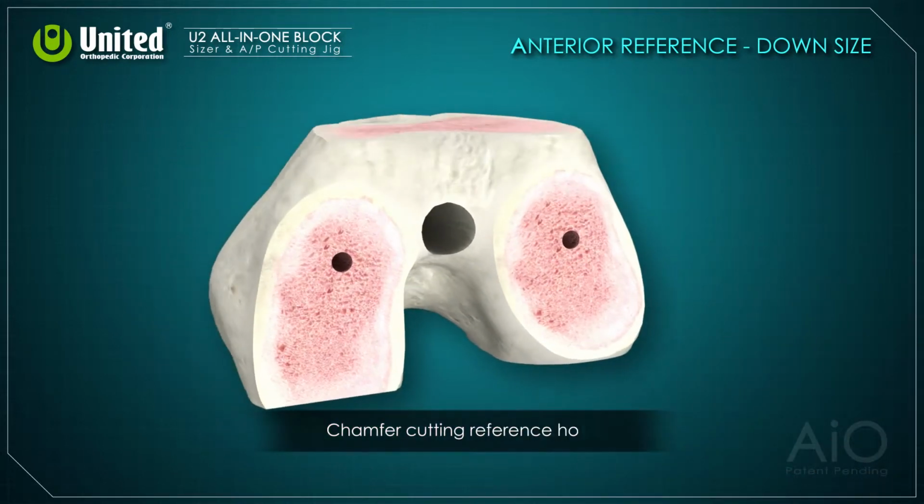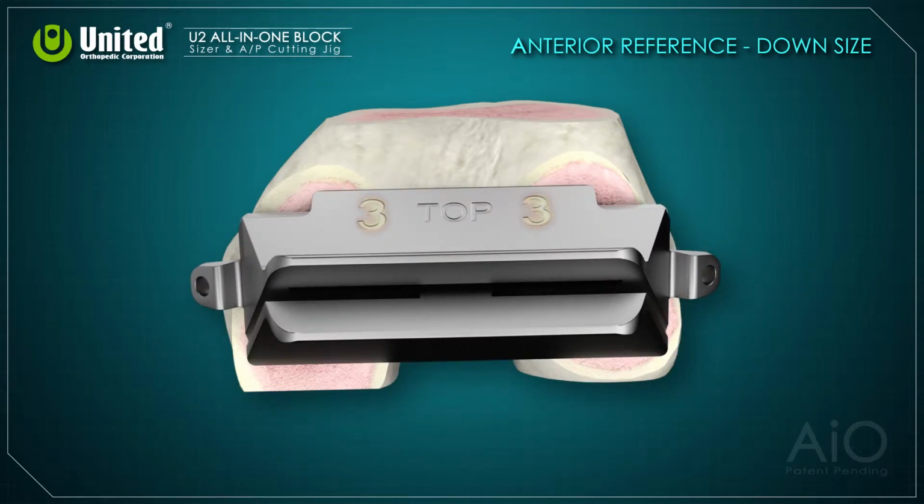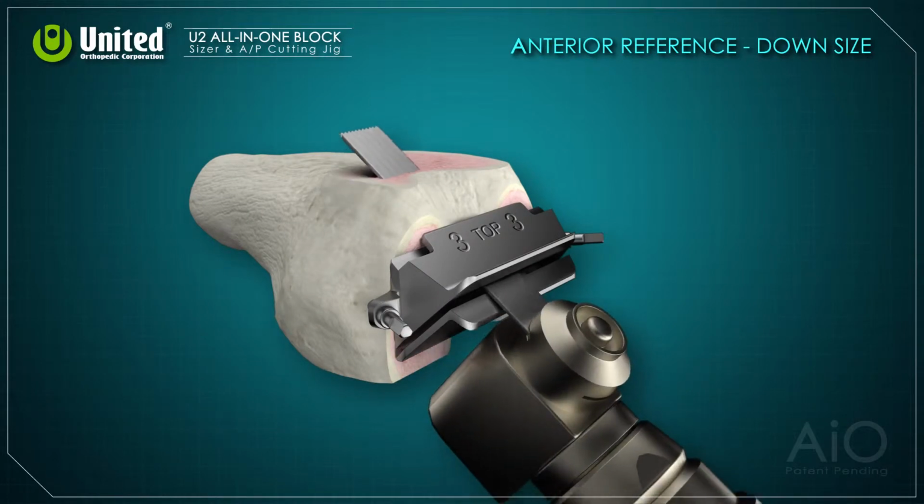Fix the chosen femoral chamfer cutting jig in the pre-drilled pinholes. Use the threaded pins to enhance the stability and complete the chamfer cuts.